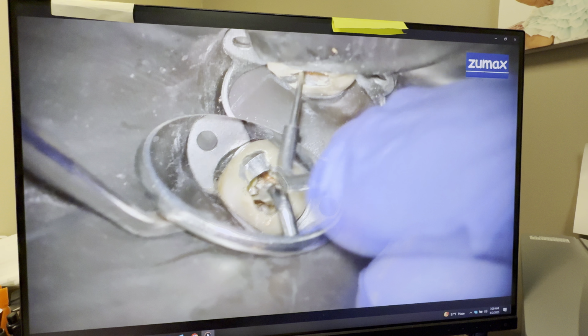Clearly, this dentist didn't know how to do a root canal properly. By the way, this is the same patient that I presented last week, Wednesday. We redid the root canal on tooth number 19 together, remember? The patient from last week. So this dentist clearly didn't know how to do root canals properly because we had to redo tooth number 19 also.